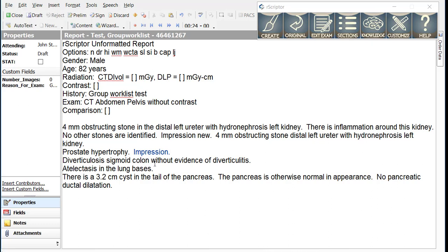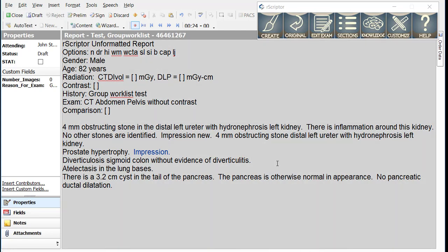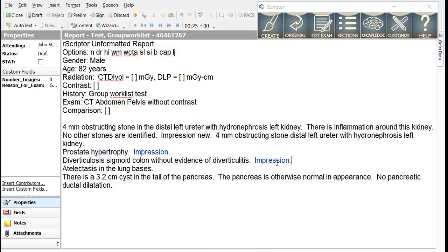Next, diverticulosis sigmoid colon without evidence of diverticulitis. Again, we can simply add impression period to copy that text into the impression. This finding is not important enough to include in the impression, so we will not add anything after that text.